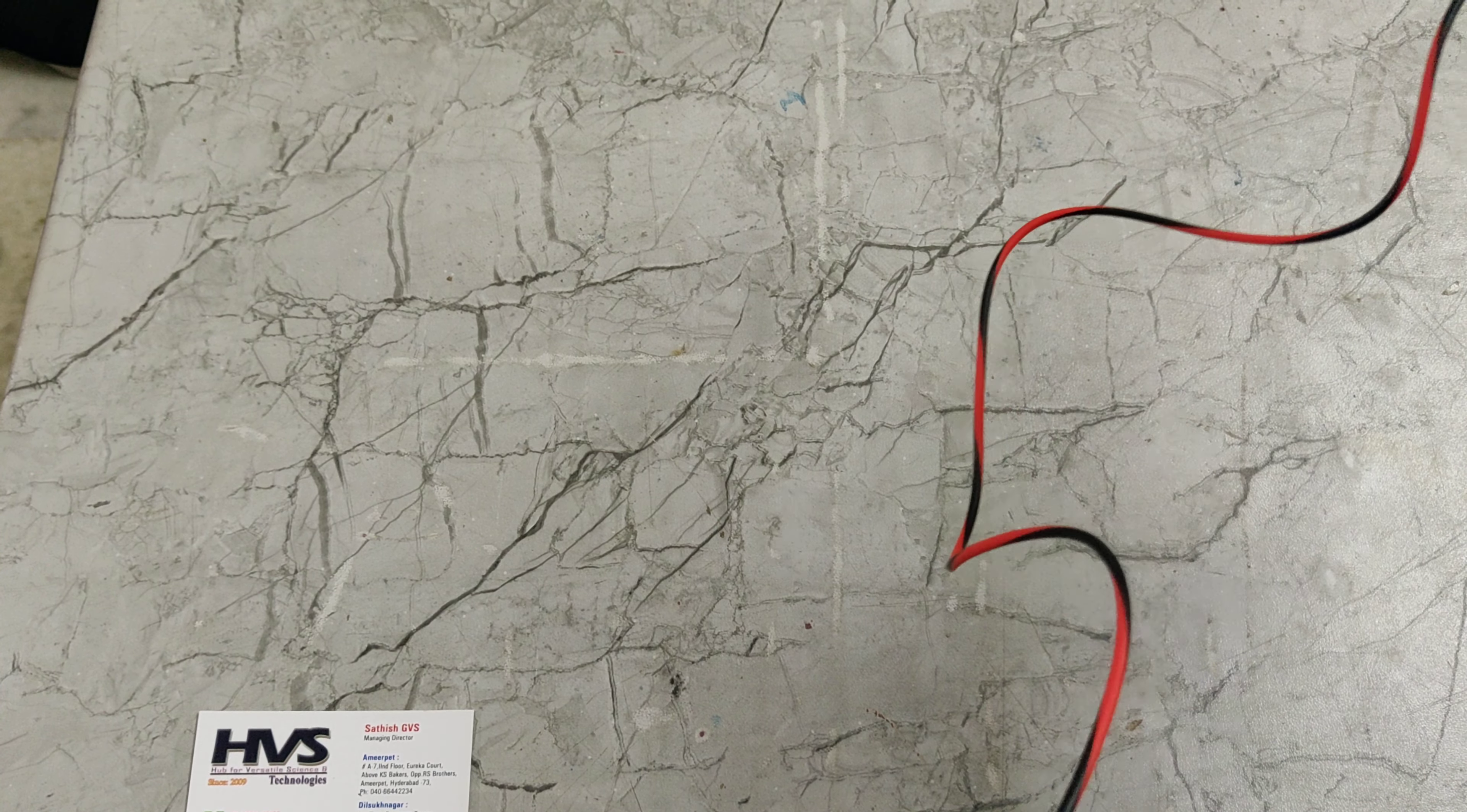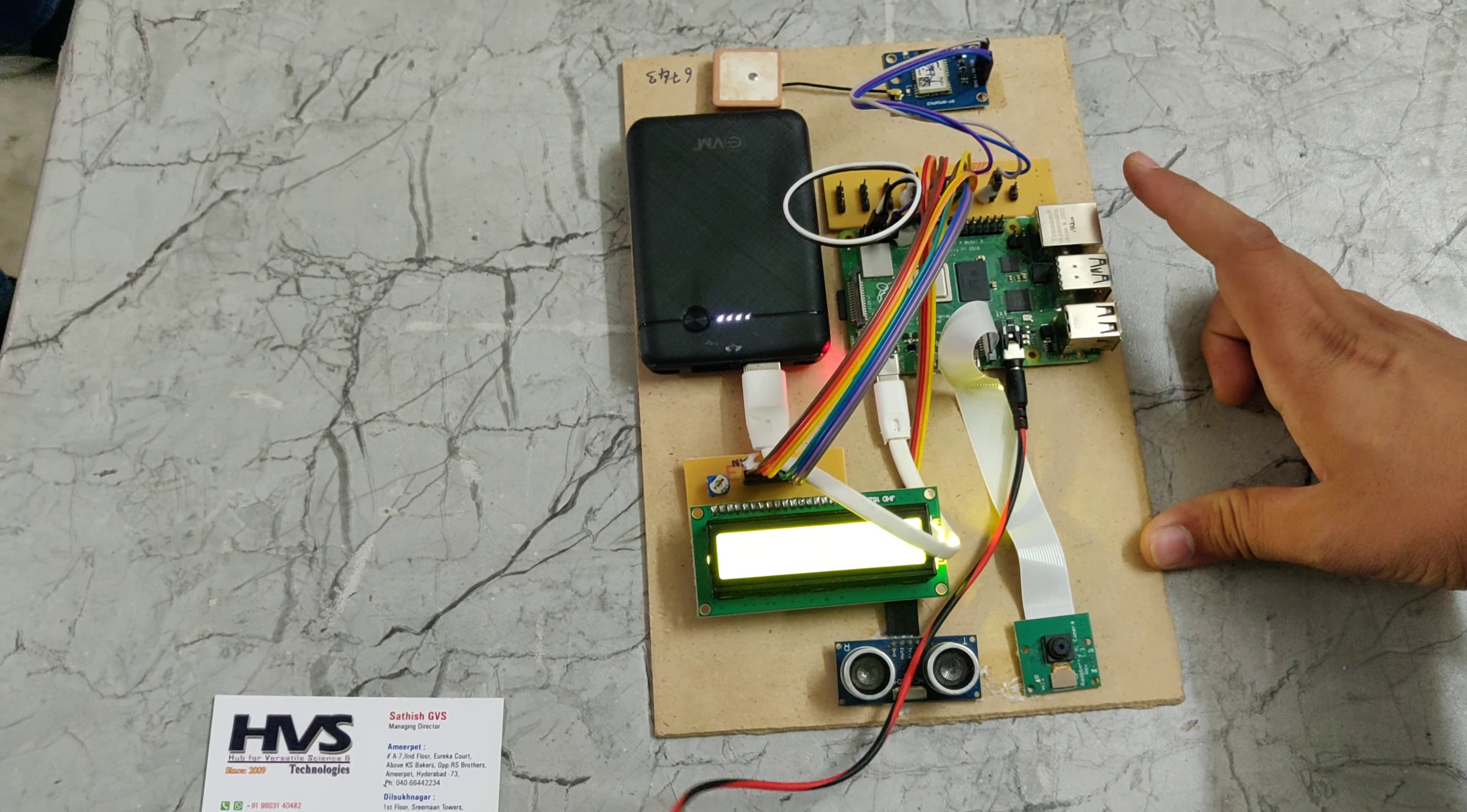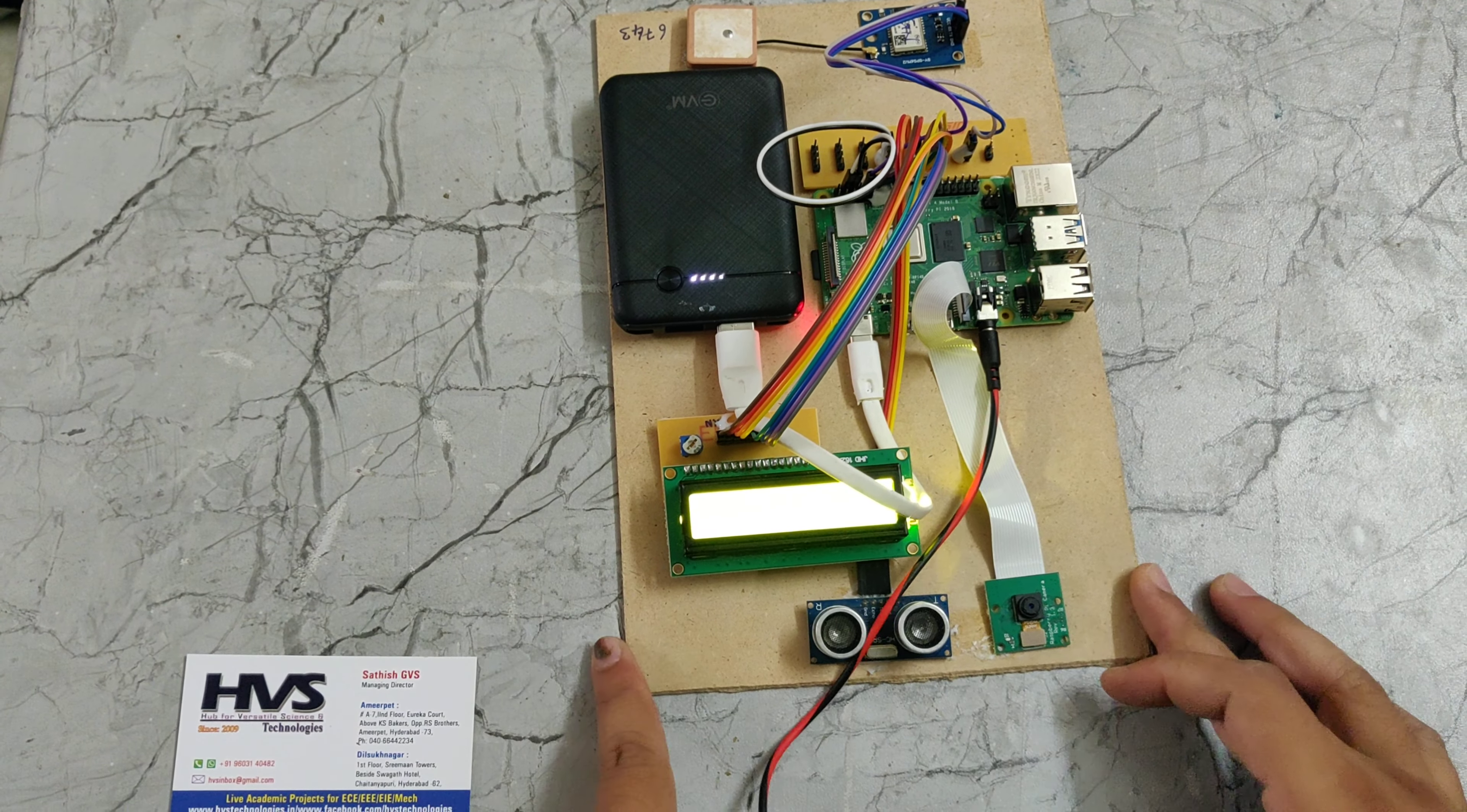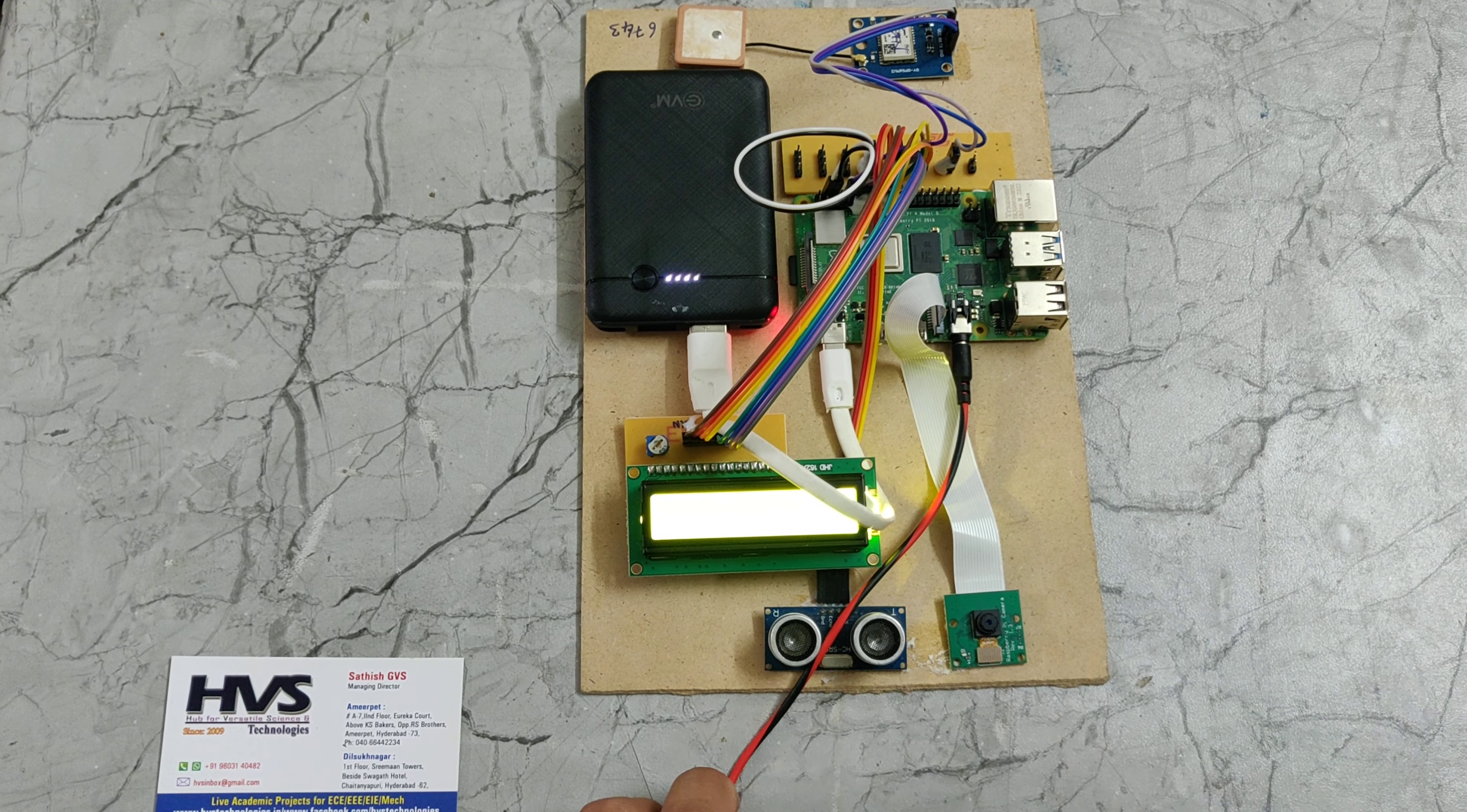In this way this project works. This Raspberry Pi camera is connected to this Raspberry Pi, and this Raspberry Pi works on Python code. We are using the algorithm called CNN, Convolutional Neural Network. In that algorithm we will identify the persons and different objects in this code.